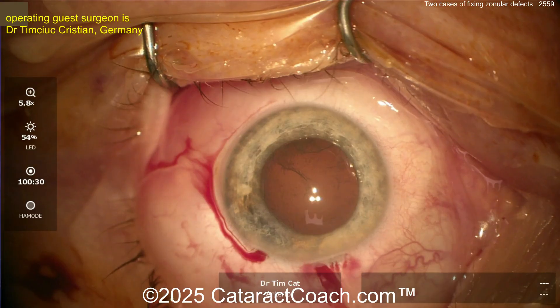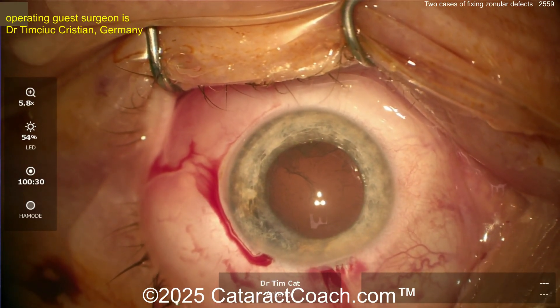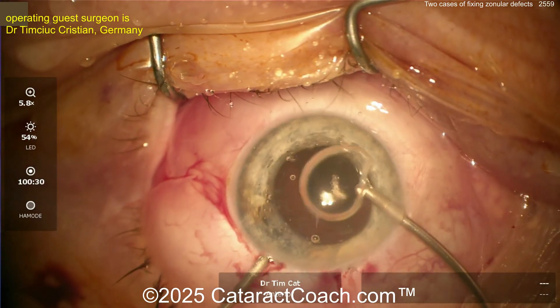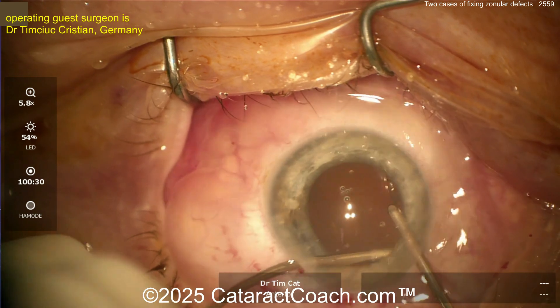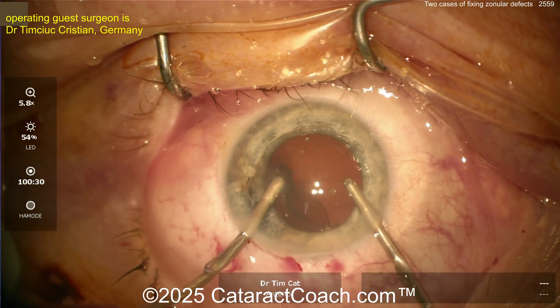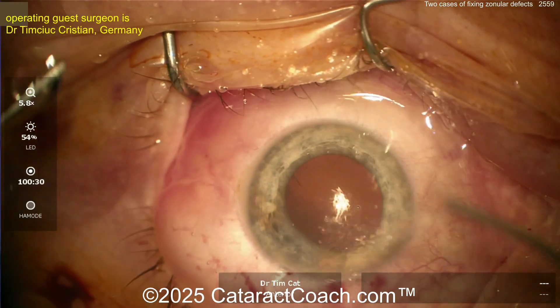Probably a bimanual I/A setup — my guess, just like the first case. When doing this you've got to be very careful; you can strip away the zonules just with the suction of the bimanual I/A. Aspirator in the left hand, infusion in the right — taking out the lens material very nicely. Coming out very well; looking at the rhexis edge to make sure it doesn't move.